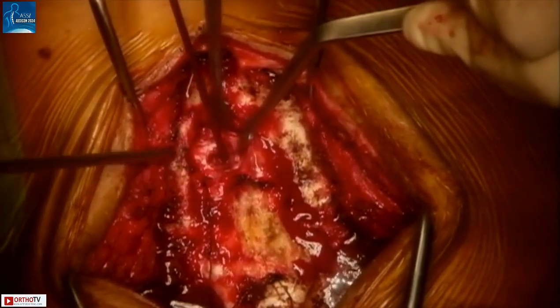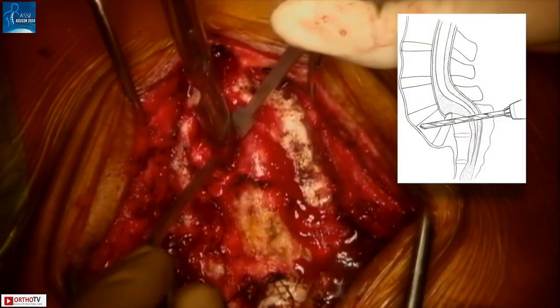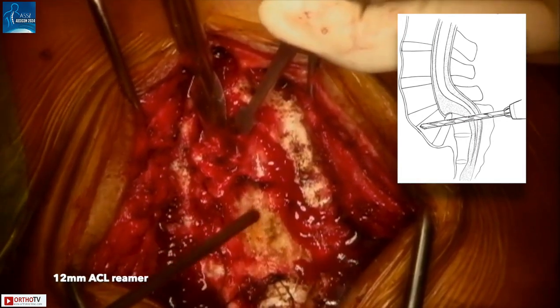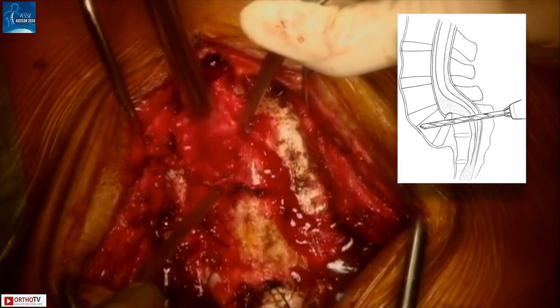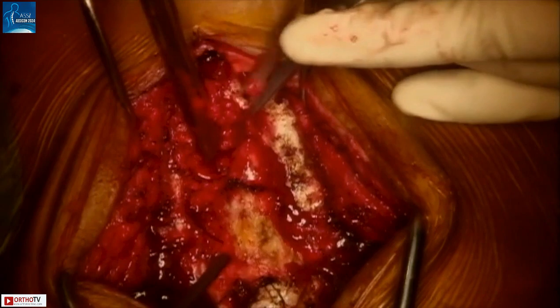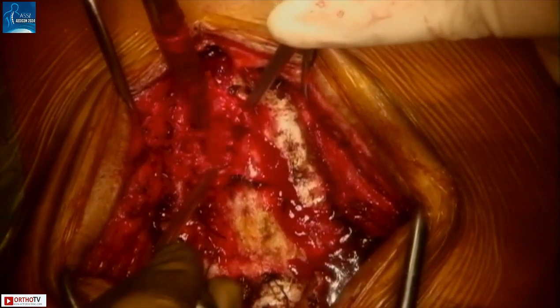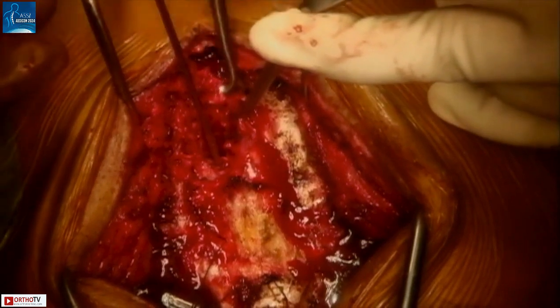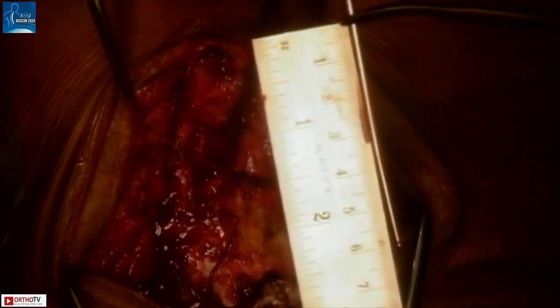In preparation for the reaming, make sure you have adequate room, ensure there are no dural adhesions, and free-running EMGs should remain quiet during retraction. A 12 mm ACL reamer is used under fluoroscopic control over the guide wire. The guide wire should be long enough so that it can be held back while drilling to prevent inadvertent anterior migration. Whatever bone graft can be salvaged from the field is preserved for future use. Once adequate length is reamed as judged on fluoroscopy, the reamer is gradually withdrawn and all bone graft from the hole is salvaged. The length of the hole is measured using a ball-tip probe — in this case it is 60 mm.